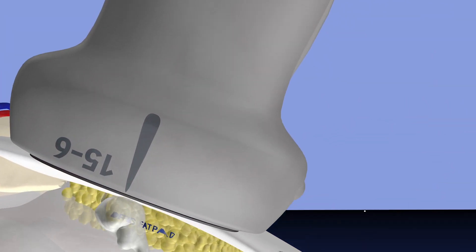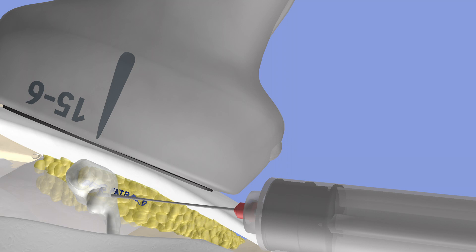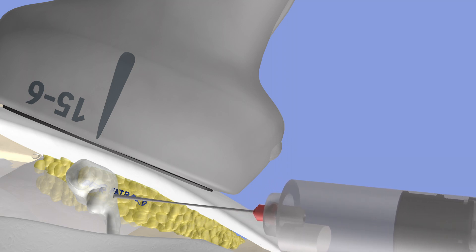Here we have our patella tendon back and we're rotating the lower extremity into the position of the procedure. Our probe is in an anterior sagittal view. We can see the needle essentially going in a long axis perspective relative to the probe. We're trying to aspirate, and we were able to just get a little bit of thick clear ganglionic type fluid. Then we proceeded with basically needle breakage of this ganglion.